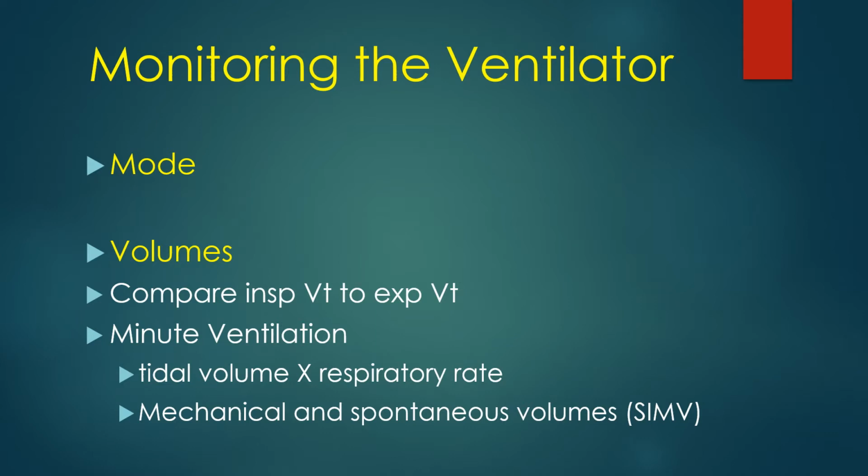Now, you also want to look to see that that's happening every breath, because sometimes a patient will not exhale completely on one breath, and then exhale more than he inhaled on the next breath. So you want to see that it's consistently the exhaled tidal volume lower than the inspired tidal volume. And so then you got to put on your Sherlock Holmes hat and try to figure out why that is happening. Very often that is that the cuff on his ET tube needs to have some air added to it.